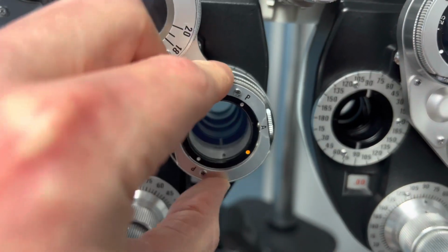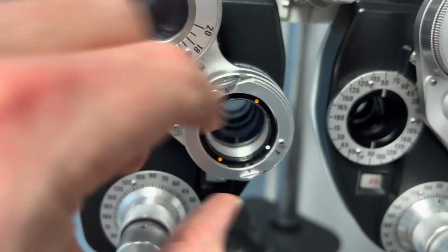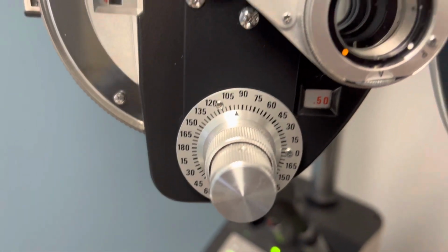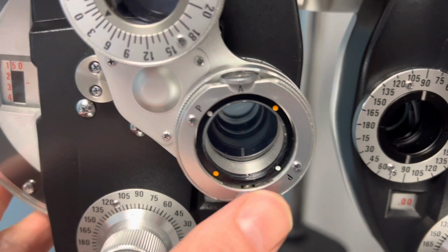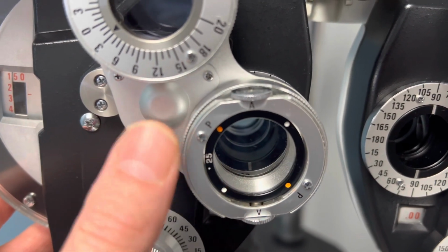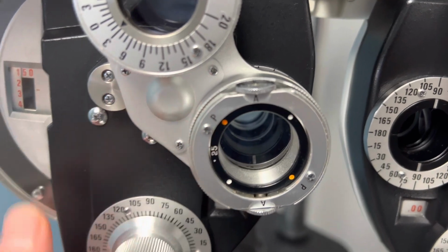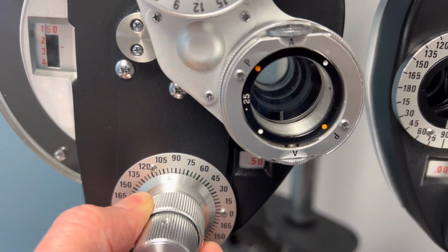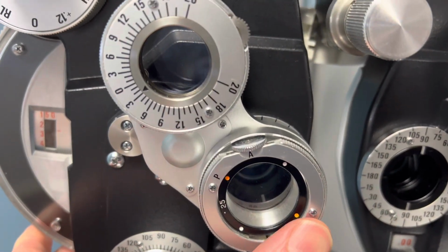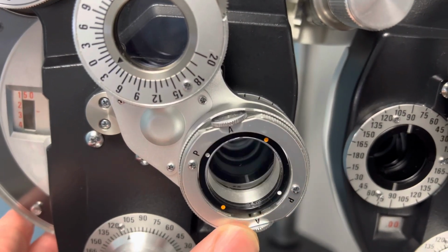The next thing we want to do is figure out what your axis is, which is this clock dial down here. So it's the same concept. I'm going to say which is better, 1 or 2. So if you pick 2, you've picked the red dot over here. So I'm going to turn this dial about 15 degrees over here. And then I'll say again, which is better, 1 or 3?